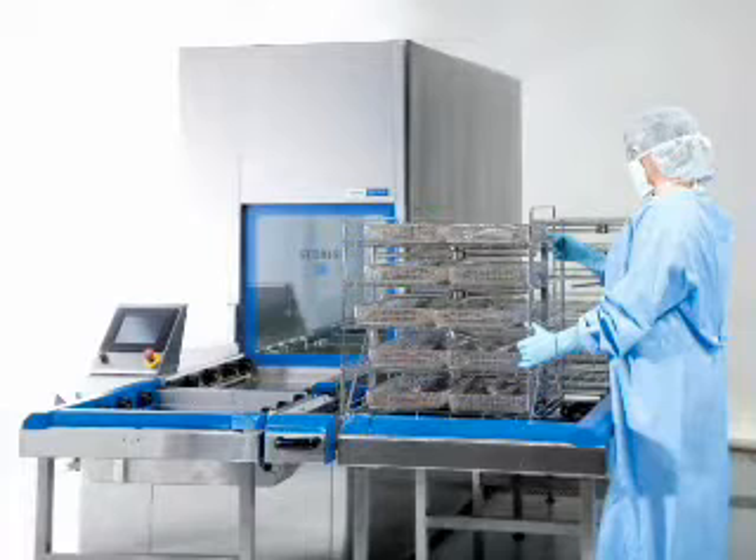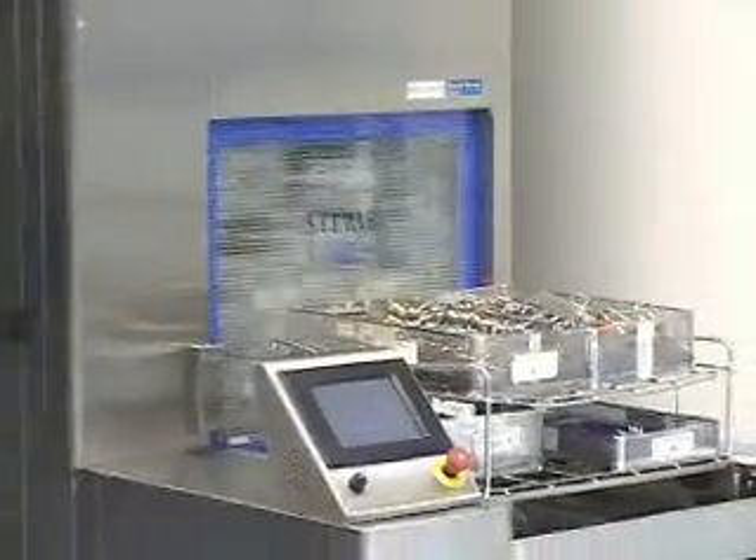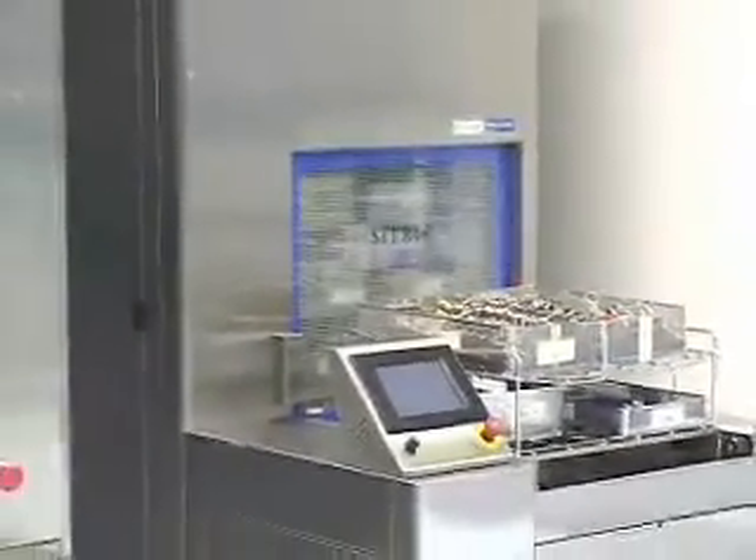The high productivity needs of today's sterile processing departments require cleaning and disinfection systems that deliver speed, efficacy, efficiency, and ergonomic operator control in less space.